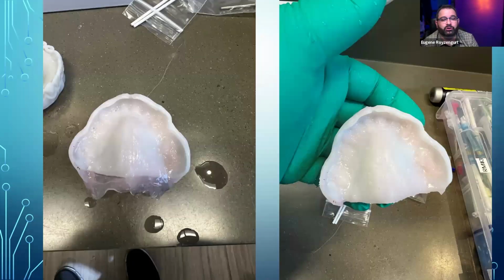So I said, you know what? I'm going to do just a try-in resin. And when we printed it, I'm like, well, that looks way too long and way too big. So basically what I did for this patient, I said, you know what? Let's do this. Let me reduce the occlusion manually here. That's what I did. And then do a reline with that Rodin soft reline material.